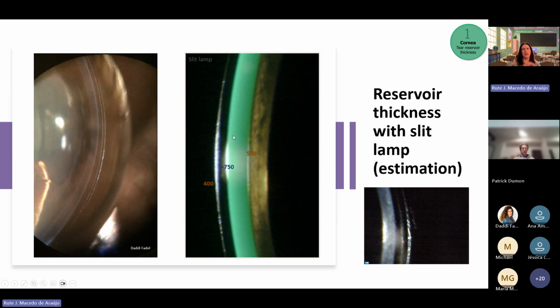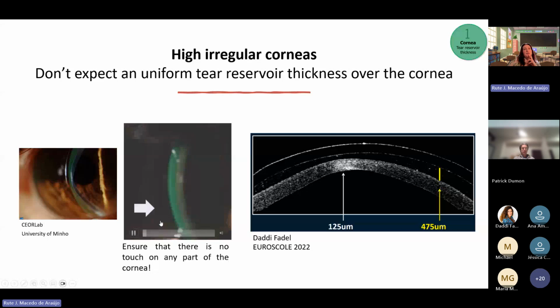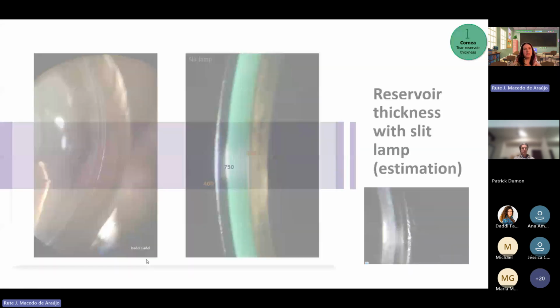And when we have fluorescein, it is very easy. We should estimate this thickness comparing this green area with the thickness of the lens, because the thickness of the lens is something that the manufacturers can give to us. When there is no fluorescein, of course you can see it, but it could be more difficult if you don't have enough experience.